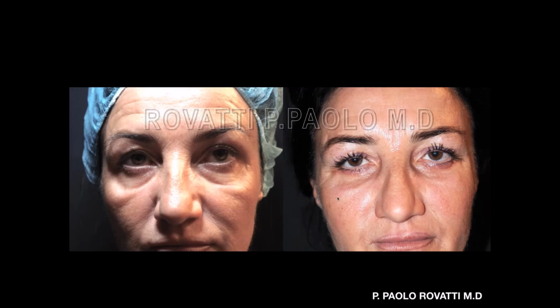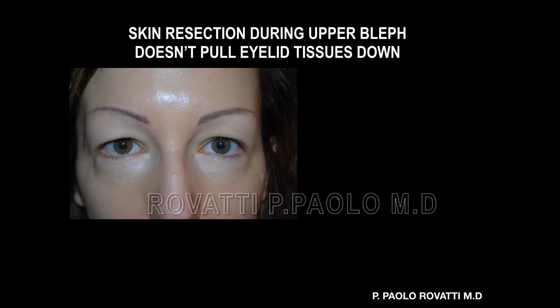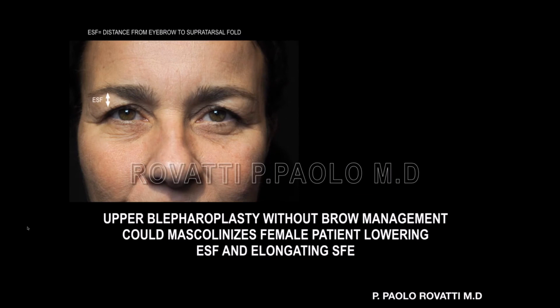What about the upper third? You know that aging pulls down the upper eyelid, and so the brow achieves a more ptotic position. But even when we do a blepharoplasty, if the skin management is gentle and not so excessive, if we reduce a little, we can have this very full area, and it's a good effect. But if we do just an upper blepharoplasty without the brow management, that we can do in many other ways. So I'm suggesting this with AccuTite, but you can do a direct brow lift, you can do a thread lift, you can do everything.